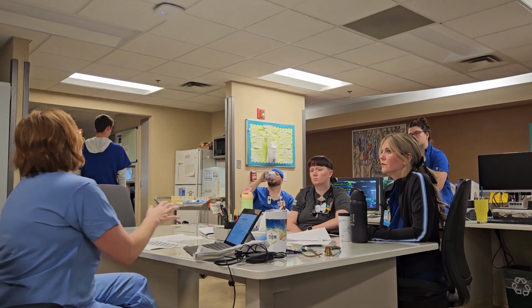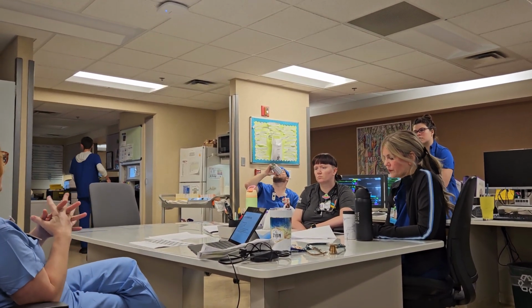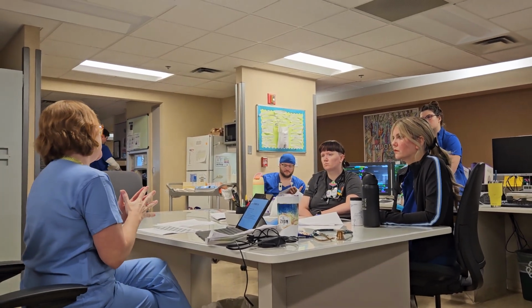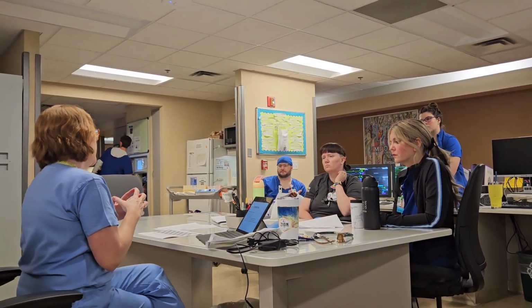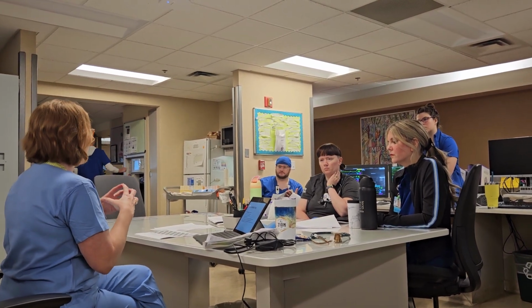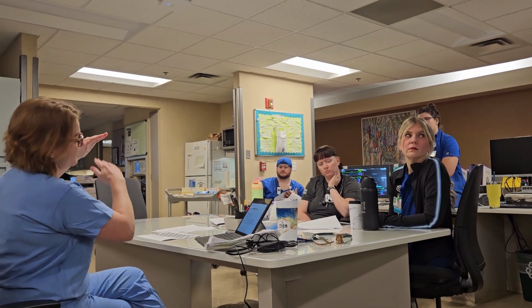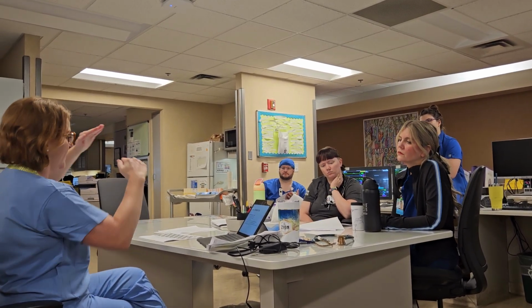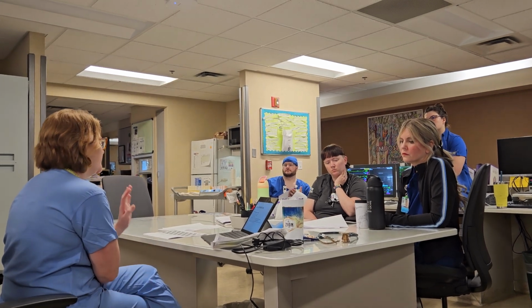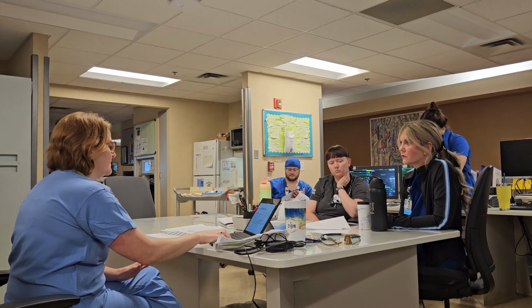So we use PEEP anywhere from 5 to 20. I won't go into how PEEP necessarily affects airway pressures right now, but if you're providing pressure support and they have an intrinsic PEEP, they kind of work negatively against one another, so you do have to take that into consideration, but I won't go into details with that right now. PEEP is a good thing.